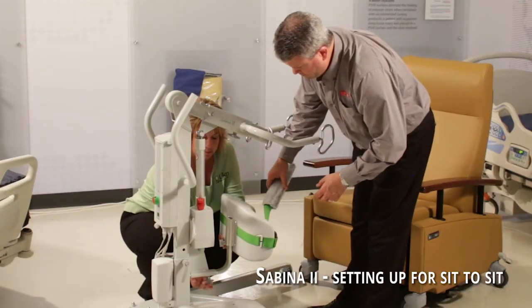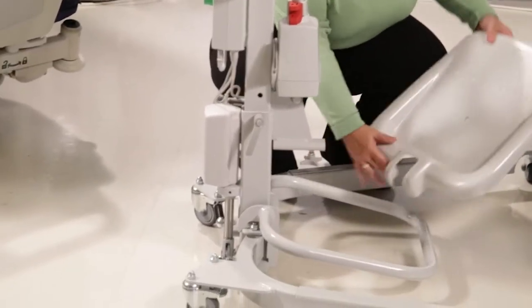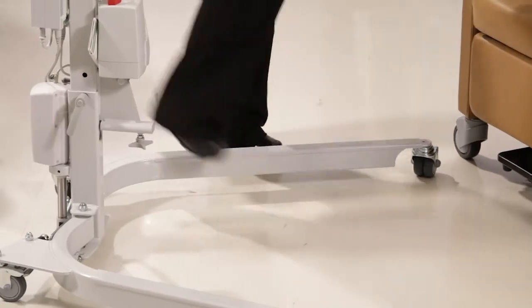You're going to unbolt this at the bottom, pull the leg part off, and then the foot pedal easily lifts off. Now the leg and feet section are out of the way.